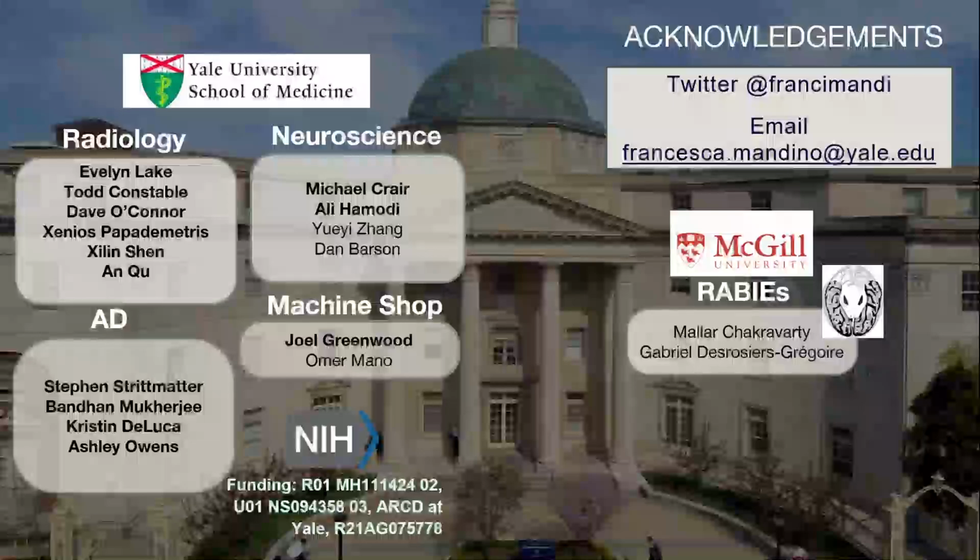Oh, skull drilling. Yeah. So by looking at the surgery, we ensure that the skull is intact. And by applying the implant, those implants were put on at 3 months, and they stayed on until 12. At the end, we could see some deterioration around the edge of the surgery, but not in the middle of the brain. There was one case, for example, where the skull was punctured, and there was a full regrowth of the blood vessels within the glass. That was quite cool, but I couldn't show it here. We would discard those kinds of animals, but it was only one case.